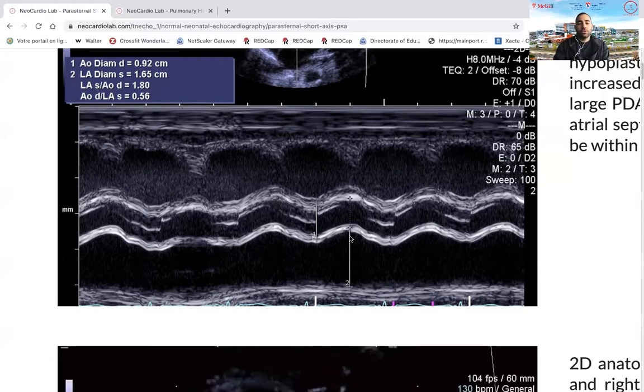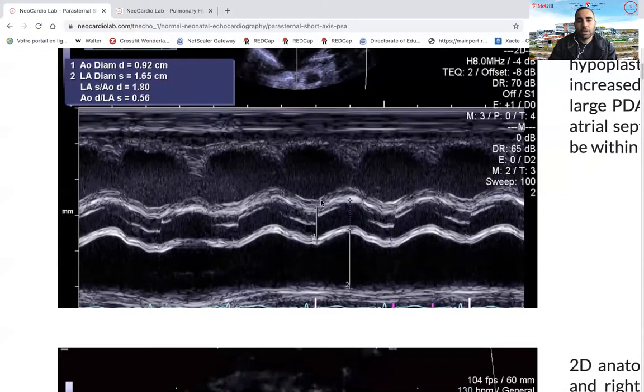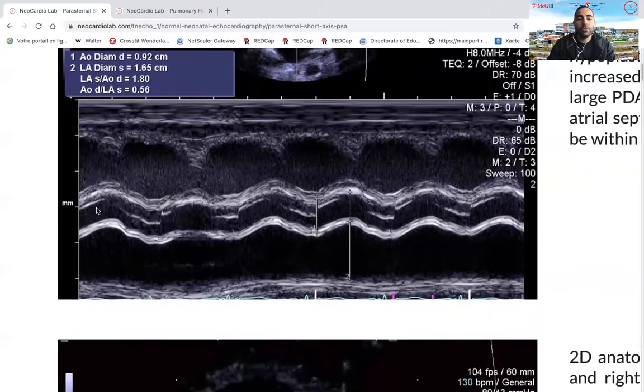And this is the ratio of the left atrium at the peak of the filling of the left atrium, which typically will be the most filled when the ventricles are actually emptying. And so the ratio of the left atrium to aorta will give you a sense of the degree of LA dilation. Now, beware that if you have a small aorta, this ratio may also be increased.